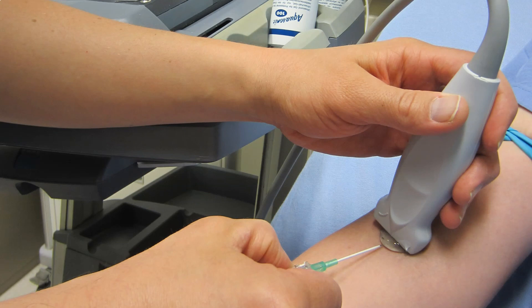This picture is of course an example of bad technique. Notice the person not wearing gloves, notice the poor position of the ultrasound probe, and notice the lack of a probe cover. But we're going to walk through the basics of how to place an ultrasound guided IV over the next few minutes and then hopefully you should be able to get some practice so that you can gain proficiency with this skill.